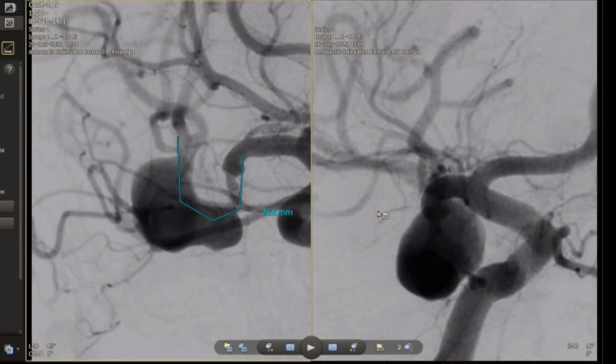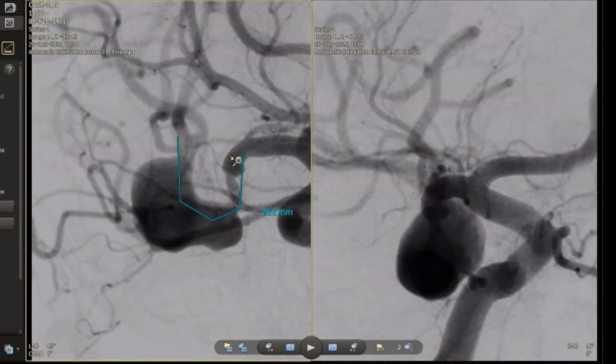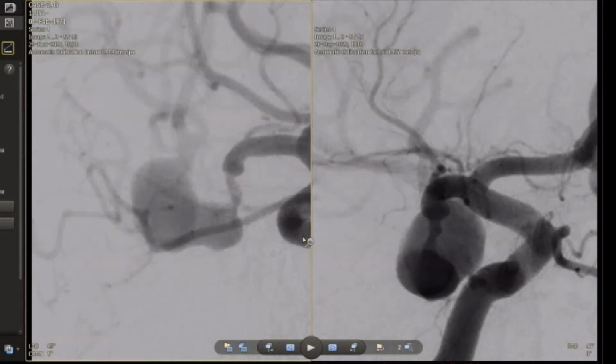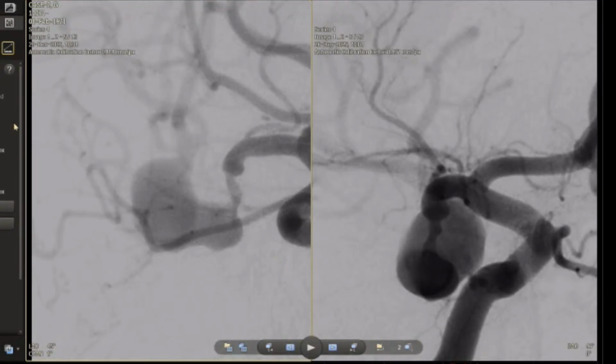But the idea is to place the braided stent, because this segment is also aneurysm. Till this point, it's an aneurysm. The bypass is patent. That's why there is a dilemma. Should we protect the MCA, place stents, or just occlude the artery? It's all the time a dilemma.